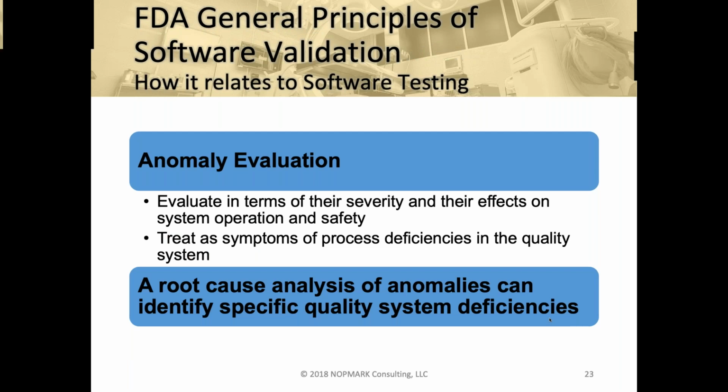So these defects, the first bullet we just talked about, these defects that you have in the software have to go through this assessment. Once you're in the medical device world, once you start finding these defects in verification, there is this overhead that the team, or individuals within a team, have to assess the defects with the impact on the severity.